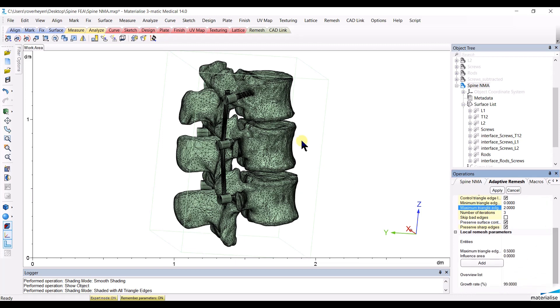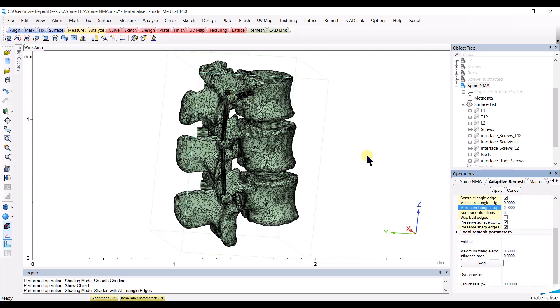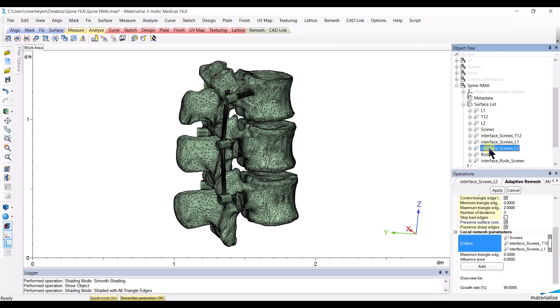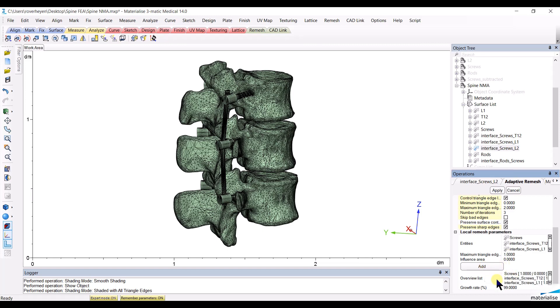Then, since I want the screws and the rods to have a different mesh size than the vertebrae, I will enter local meshing parameters. Namely, for the screws and their interface with the vertebrae, I will choose a mesh size of 1 mm and add this to the list of local parameters.